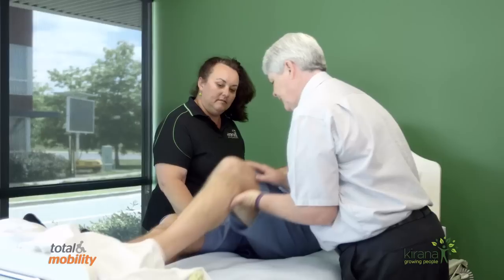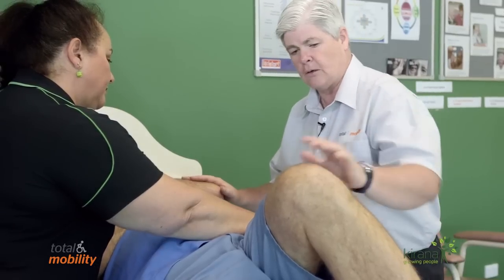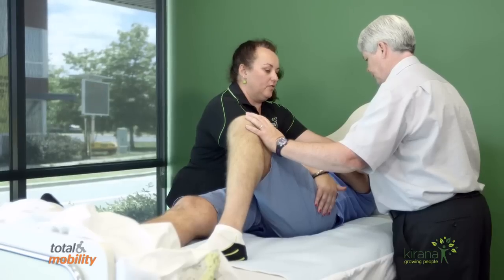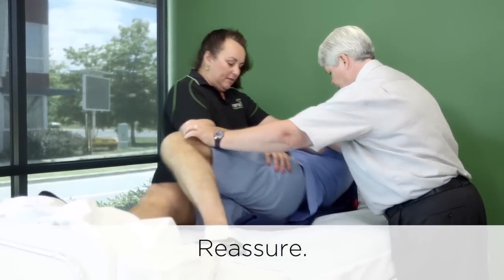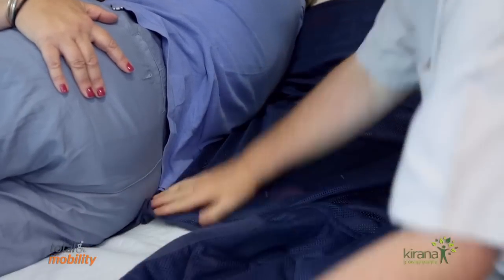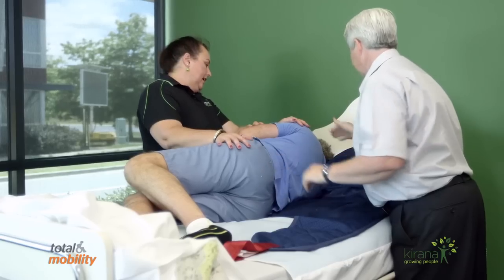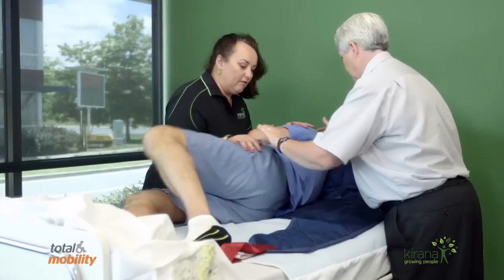So bending your knee up. I'm going to place my hand on your hip and your shoulder; I have my hand on your elbow and knee. We're going to roll to Melissa. We're in the correct manual handling positions — our feet are shoulder width apart. So we're going to count to three: one, two, three, roll towards me. You're safe Mr. Williams, you're not going to fall. I'm just going to pull the sling out underneath you, flattening it out, making sure there are no creases or bumps and it's in the right position. So I'm going to count to three Mr. Williams and roll you on your back — the sling's behind you now — one, two, three, rolling right back. Well done.